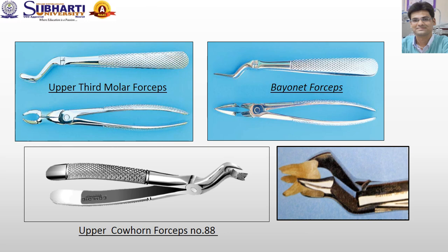Bayonet forceps are meant for extraction of the maxillary root stumps. Another forceps is the upper maxillary cow horn forceps, number 88, again available in pairs. These instruments have a very sharp, accentuated pointed beak that is placed on the buccal side on the furcation area. They are meant for extraction of grossly decayed teeth with intact furcation of upper molars. Based upon these features, again they are left and right side.